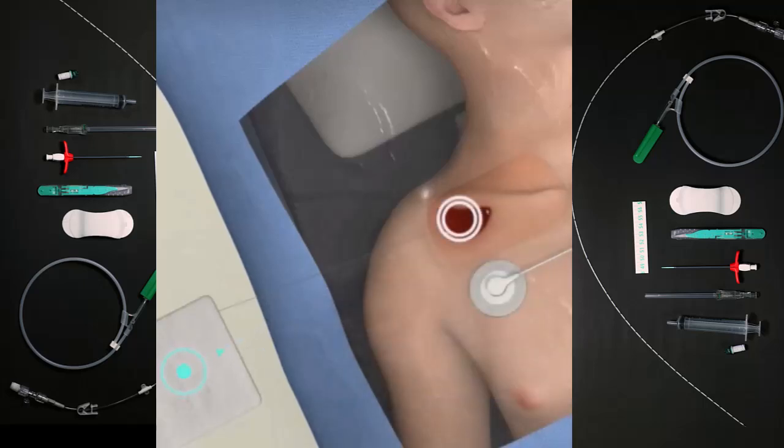If there is excessive bleeding, place the gauze over the guidewire entry site and hold pressure to control bleeding.